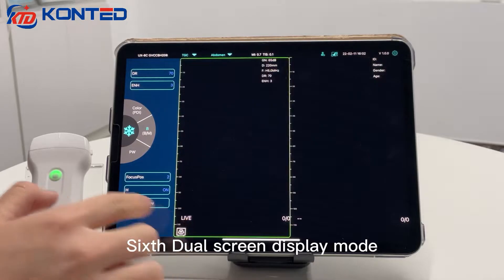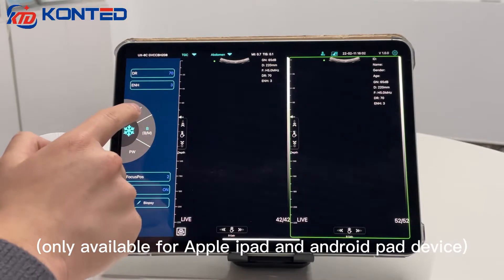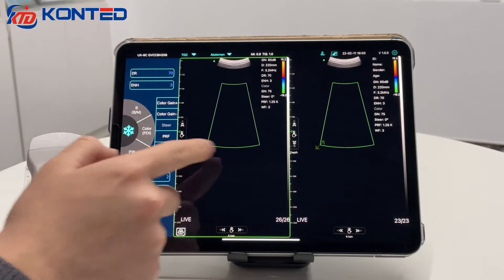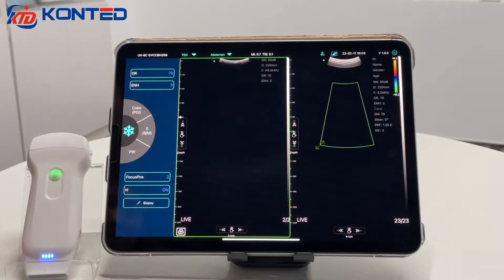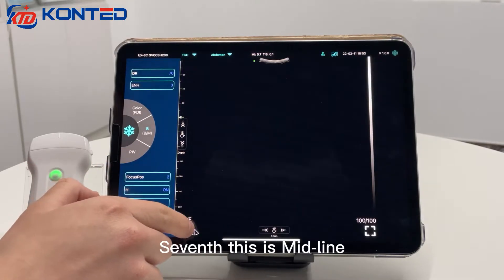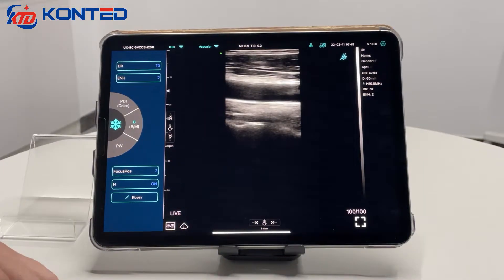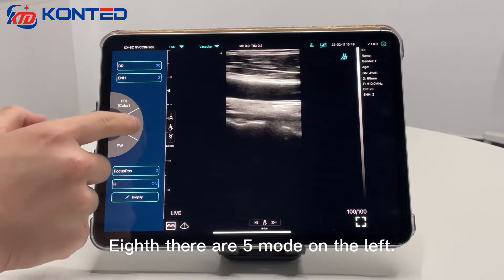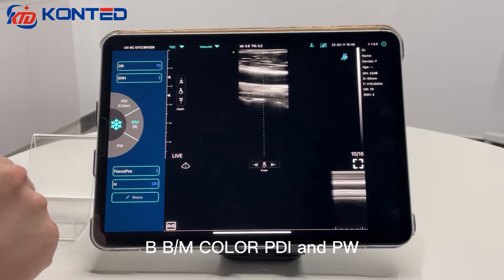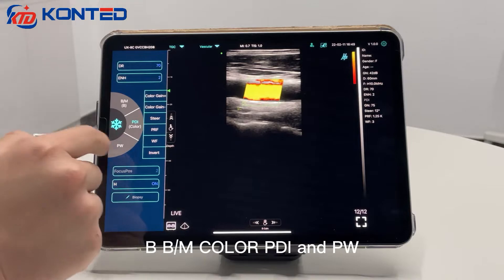Sixth: Dual Screen Display Mode, only available for Apple iPad and Android Pad devices. Seventh: this is the middle line. Eighth: there are file modes on the left — B, BM, Color, PDI, and PW.